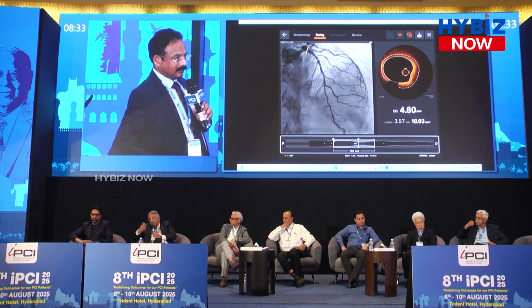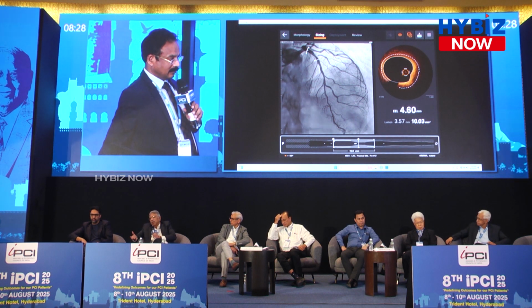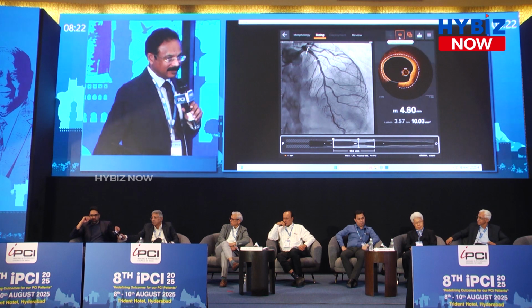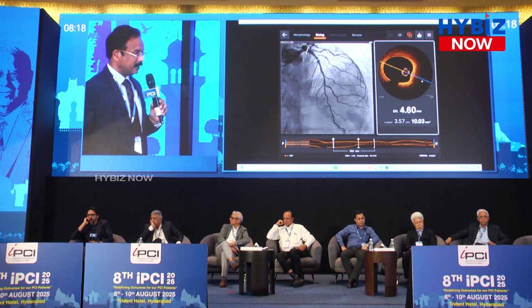The EL is detected over a 180 degree arc. You presume the plaque burden. So the plaque burden really is not an entity that we should be talking about in OCT. Yeah, right. I fully agree, the plaque burden is calculated by the IVUS, and there the guideline is less than 50% of the plaque at the landing zone.